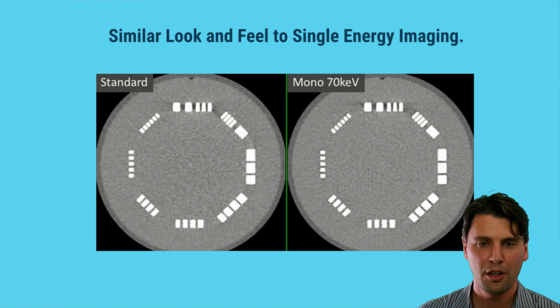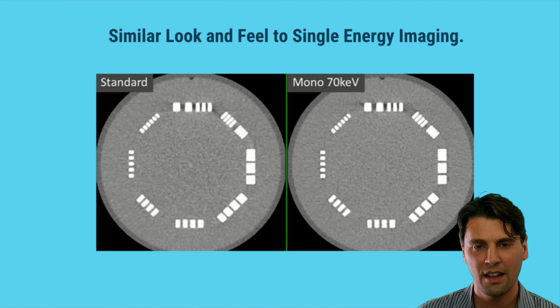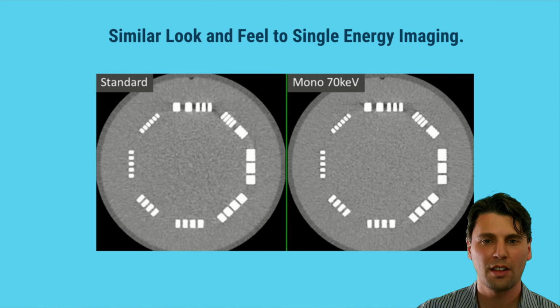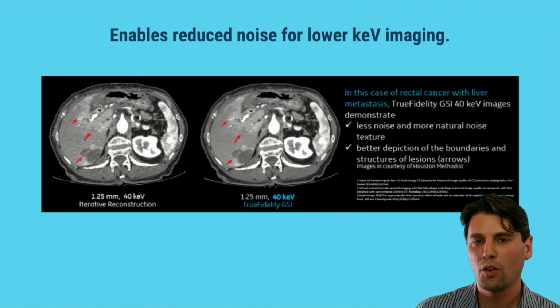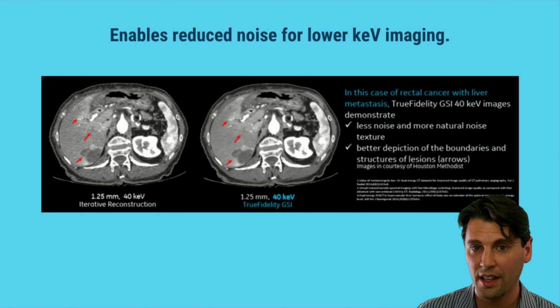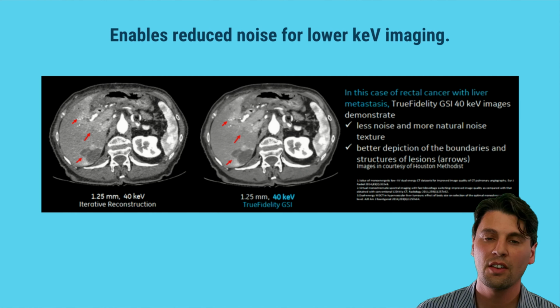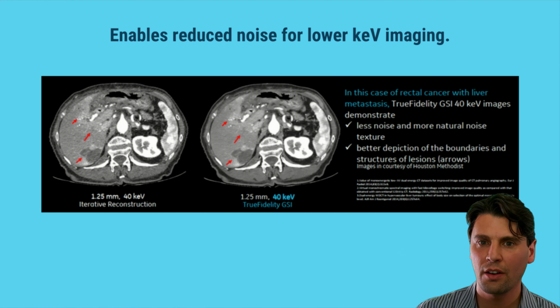Sometimes if you're trying to essentially make up some of the decomposition data, it's difficult even just to pass some basic sanity tests. So this is part of our basic testing, that we're seeing similar levels of characteristics in just basic sanity tests. And we also talked about the thin slice imaging and single energy. Another scenario from the physics standpoint is that in addition to thinner slices, lower keV imaging also leads to noisier images in general, right? So because you're going to have the noisier imaging in general, that's another area where it is very advantageous to look at using the deep learning.